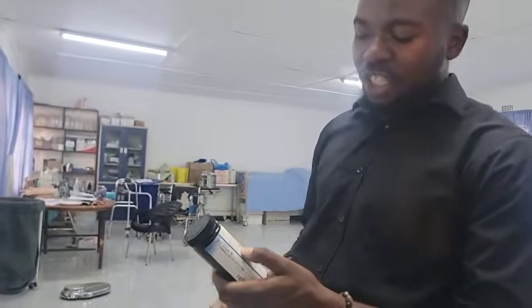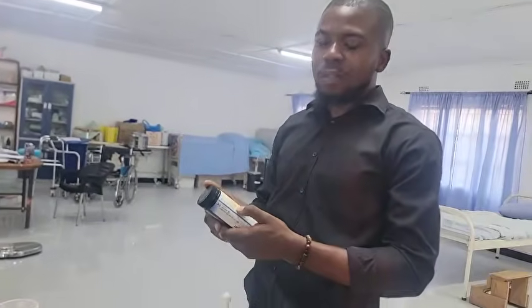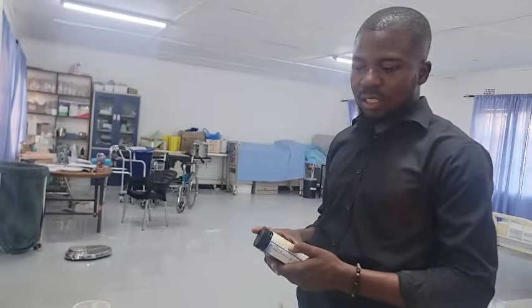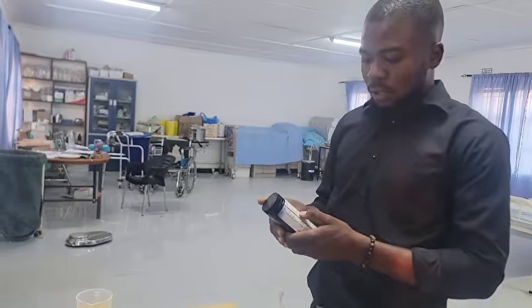Yes. What of pH? So for pH, you are looking at the alkalinity and the acidity of urine. So the normal pH of urine is supposed to be between 4.5 and 8.0. But the normal is supposed to be 6.0. So urine is acidic in nature. Yes. So if you check and you find that it's above 7.5, that simply communicates to you that the urine is alkaline, of course.